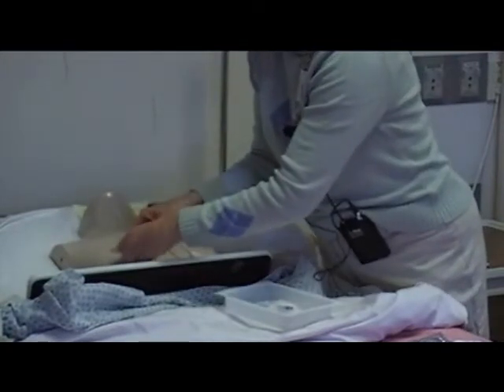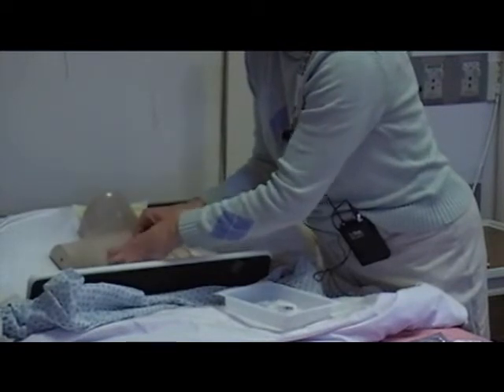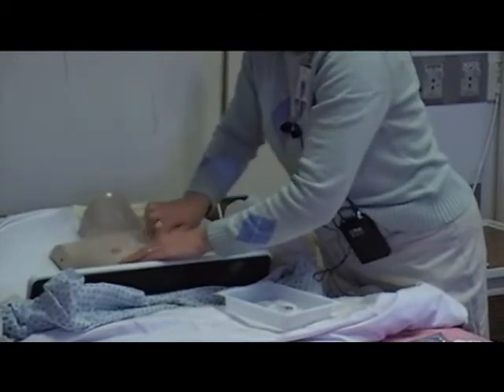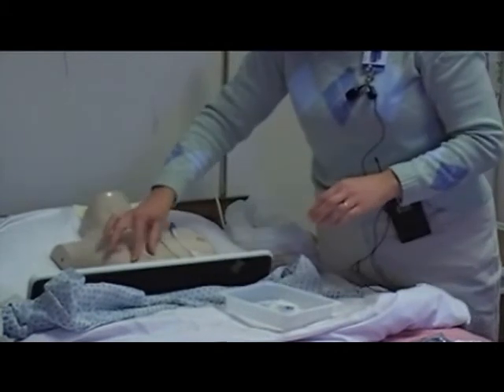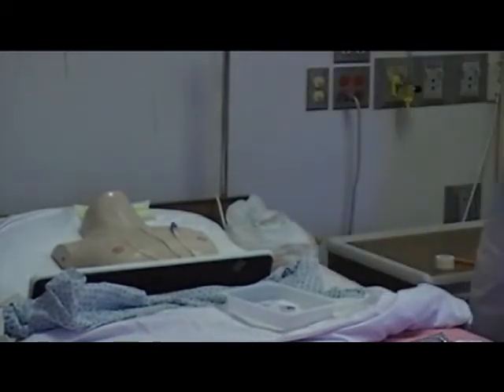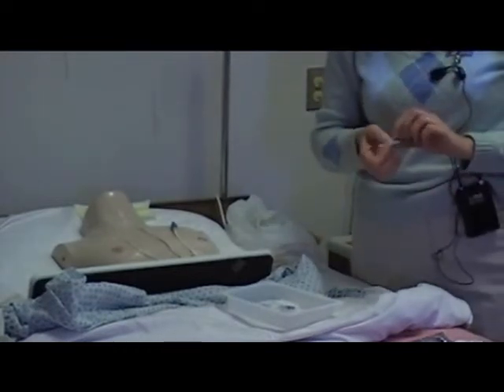And I've just made a little slit in that to work around my catheter. And then I can tape the bottom edges of the dressing. And it's okay if you do not routinely do that. It's not very often that I've had to do that. Last thing I'm going to have to do now is date and time my dressing. So I'm going to put down the date that it was changed, my initials, and that way when the next nurse comes on duty, she knows when it has to be changed again.